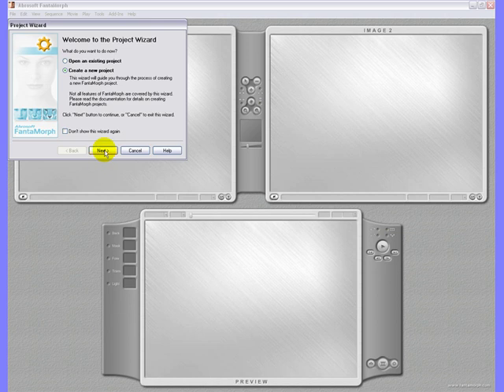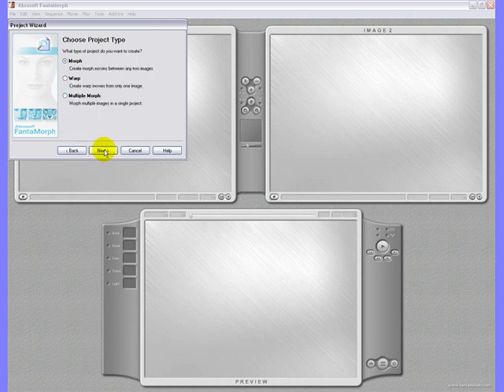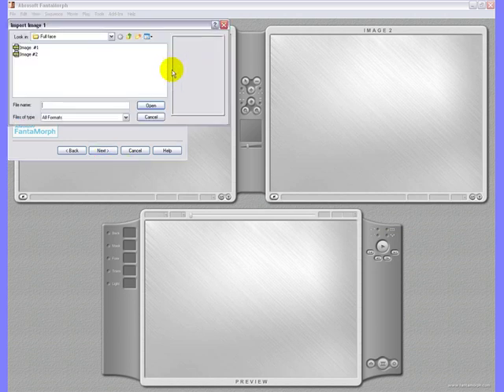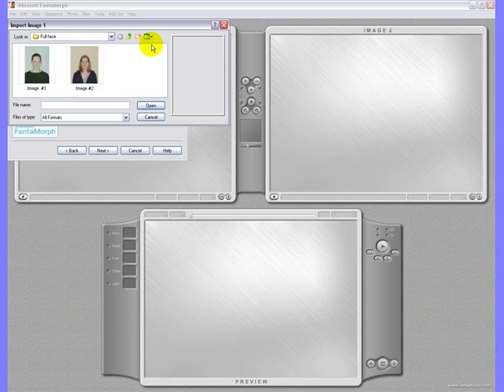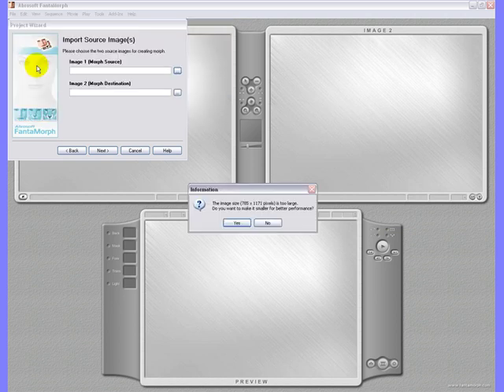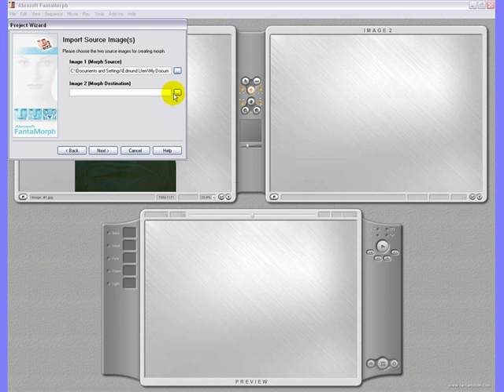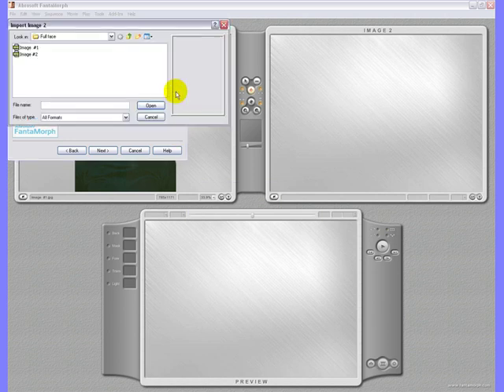Choose to create a new project. We choose morphing. Now we are going to import the images. These images are also available on the CD. Because we are going to crop these images, we choose not to minimize the resolution. Now we are going to import the second picture.